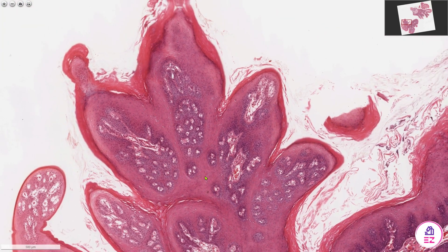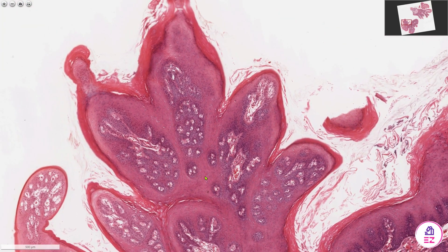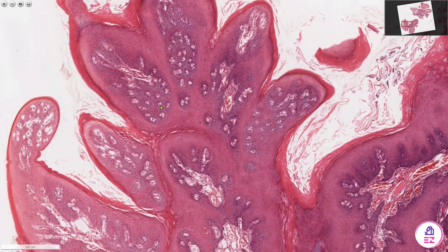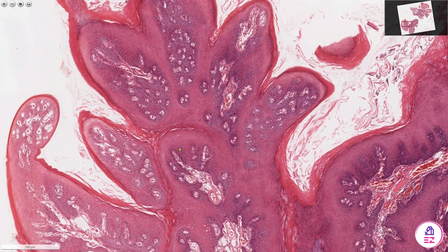Squamous papillomas sometimes have superimposed candida infection, where we'll find candida organisms within the keratinized layers. In this particular example there are no candida, but I mention it for completeness.